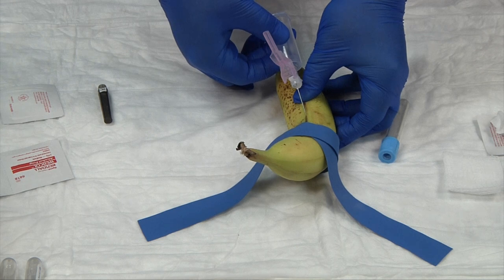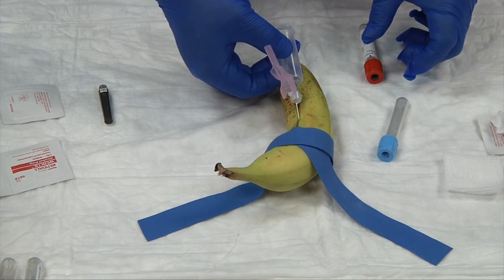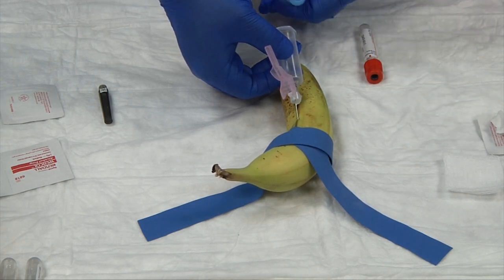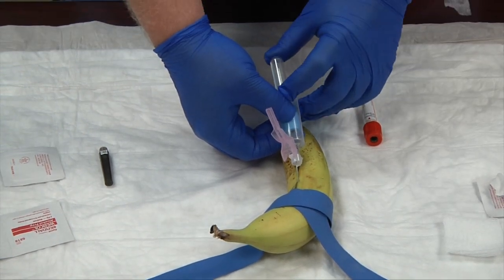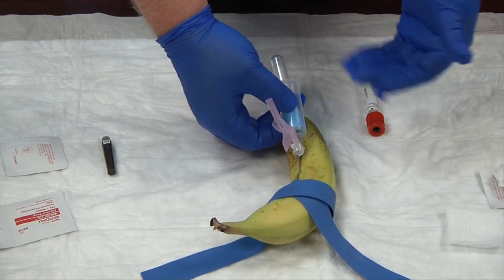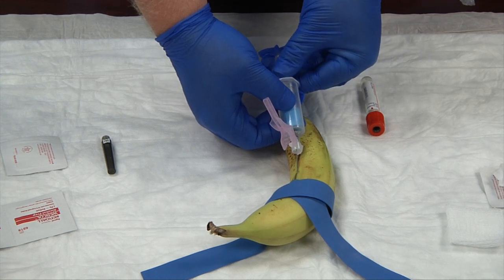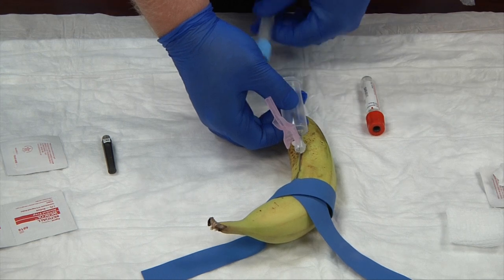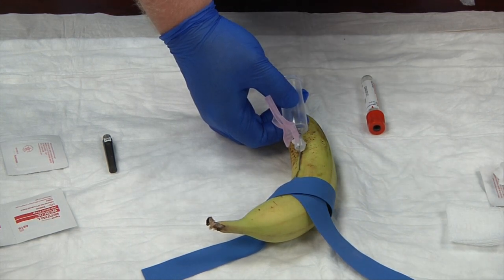I'm going to hold my needle with the safety cap pulled back, my thumb on top and two index fingers below, and stick — one, two, stick. Now I'm in my vein. I'll let go of my anchoring, and my non-dominant hand does the work. I insert my blue tube first with the label side down so you can see the blood come in. For this demonstration we'll pretend blood is flowing. Once full, pull it out gently — try not to let your needle move.